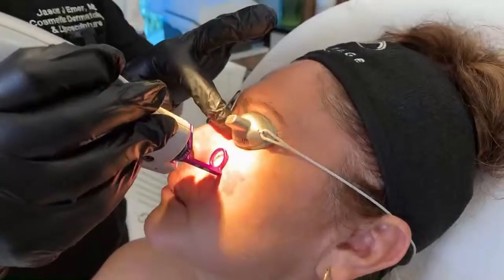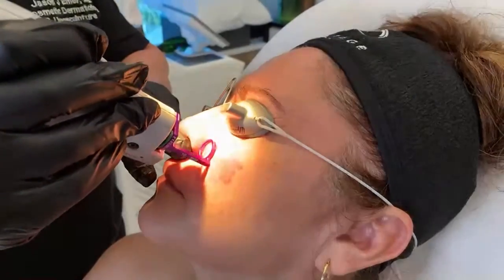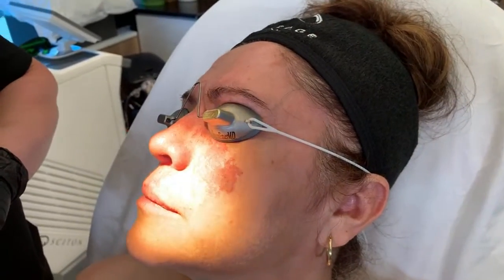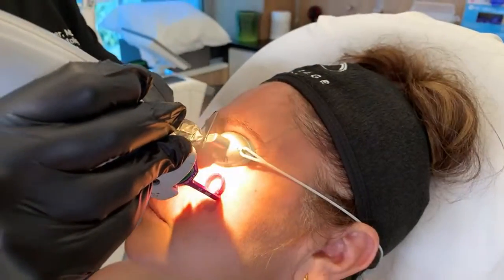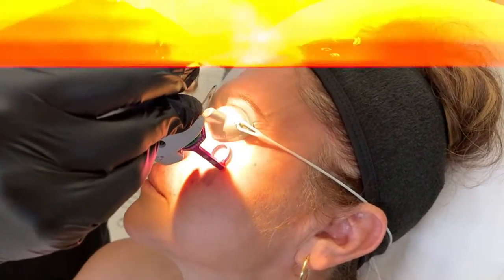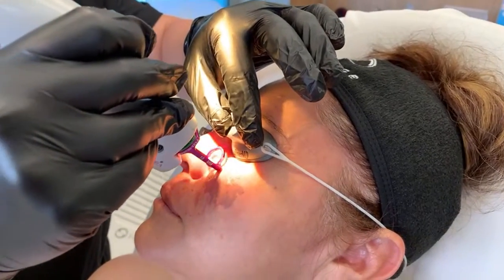There we are — investigations in progress. You're doing great. Look at that response! You see the difference already? What this means is these blood vessels are going to basically die and then slowly disappear.